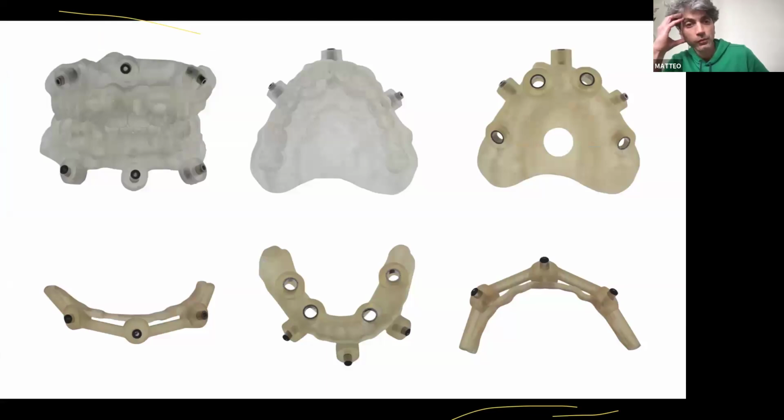Okay, for this clinical case, we have used several guides. The first guide is to position the anchor pins. We have used here only 3 anchor pins in each arch.